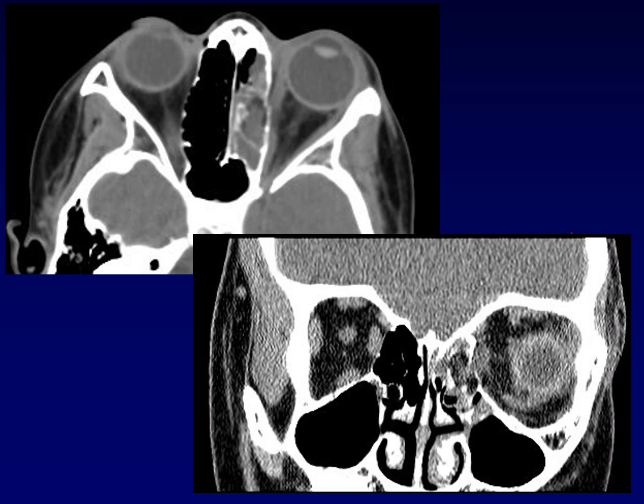Once we move to the coronal plane, it's easier to see the herniated orbital fat through the small defect, and in fact herniation of the medial rectus muscle, which turned out to be clinically entrapped in this patient.